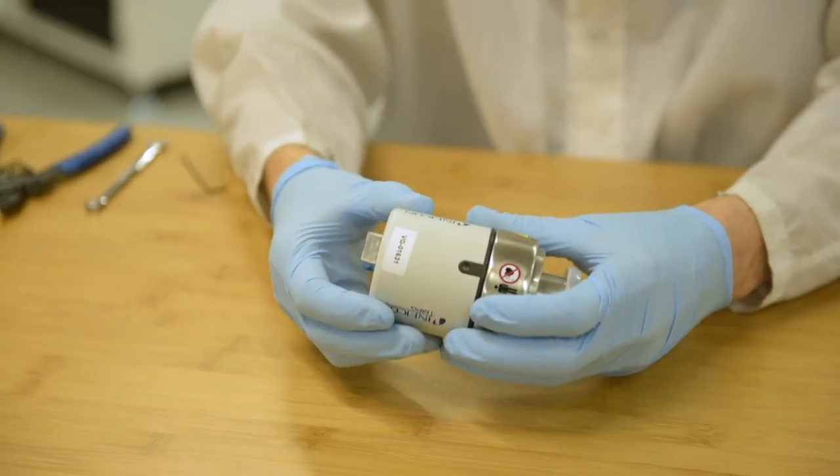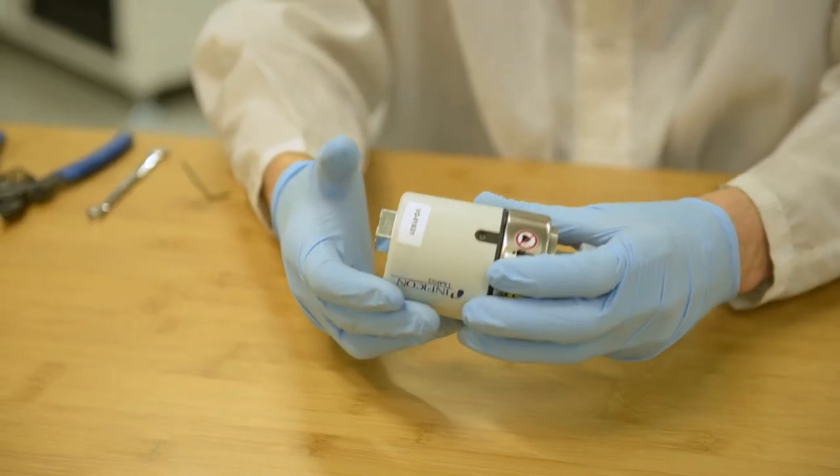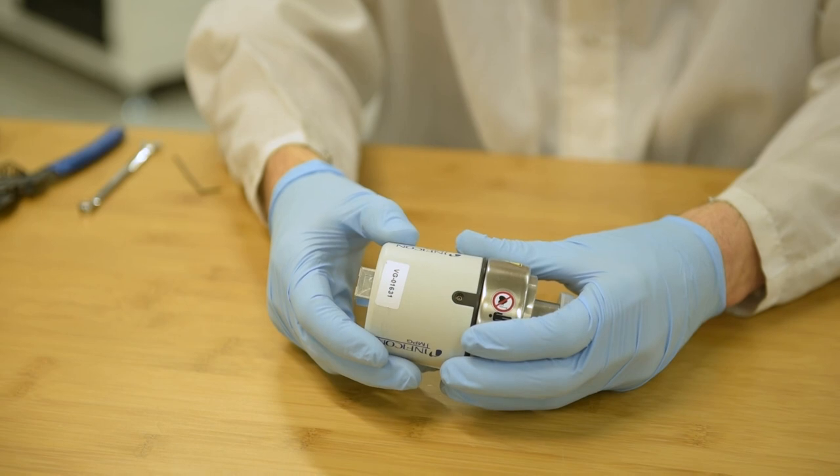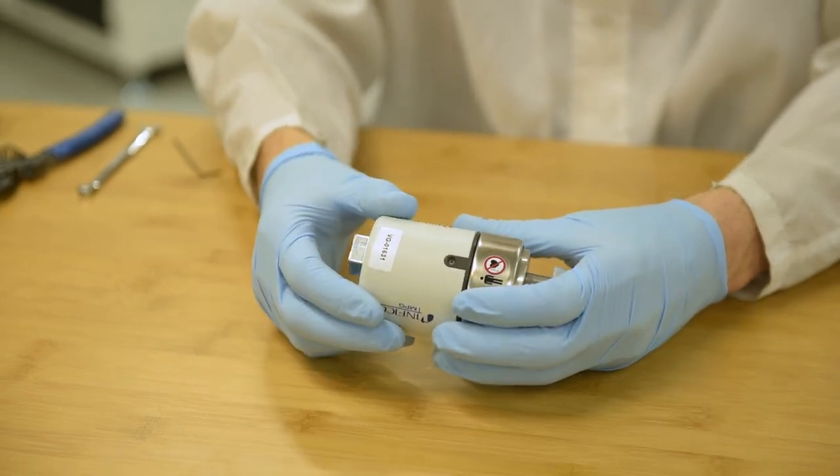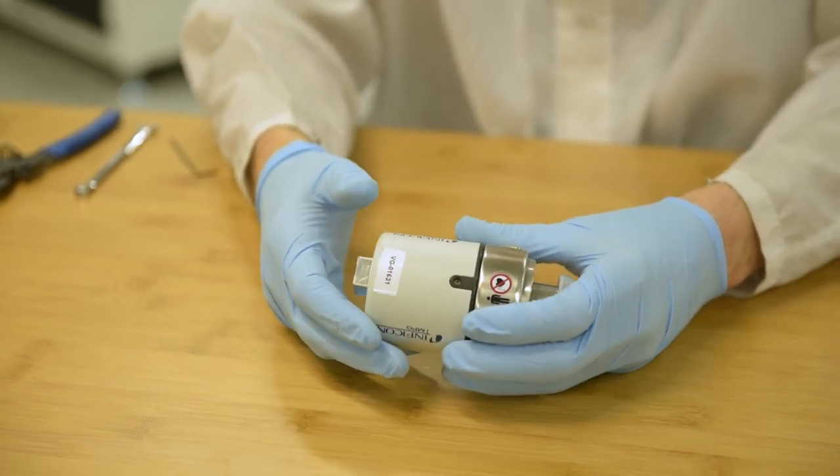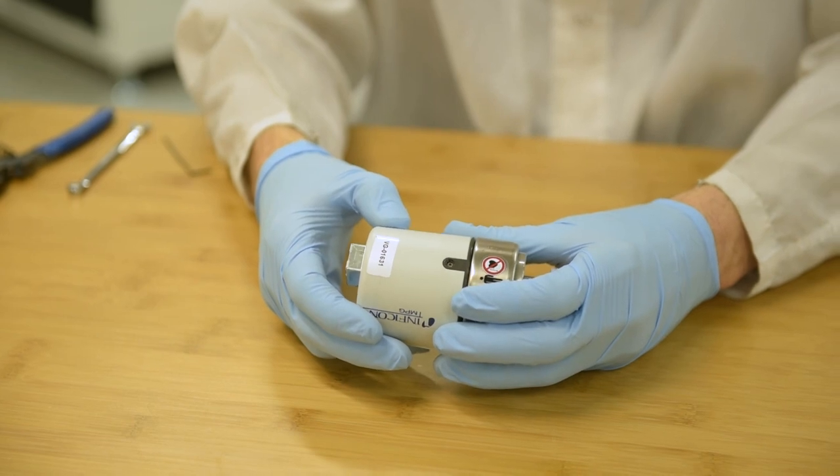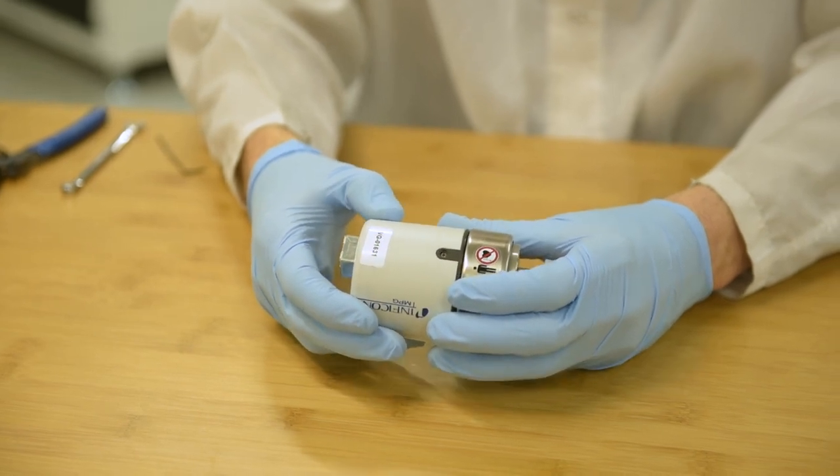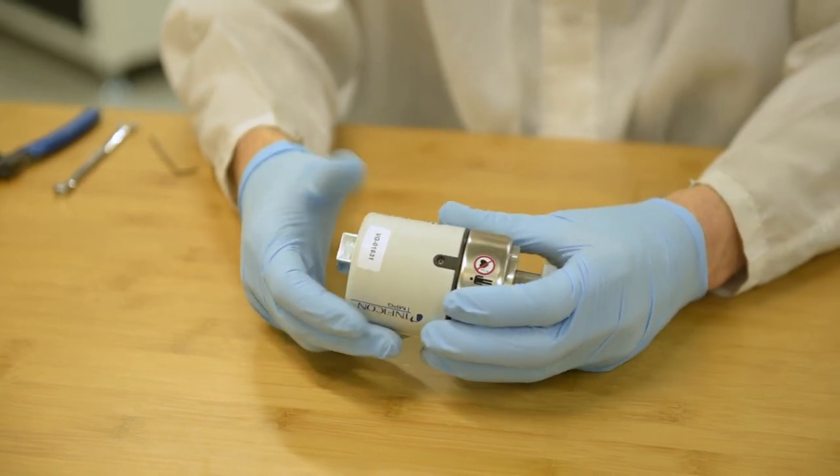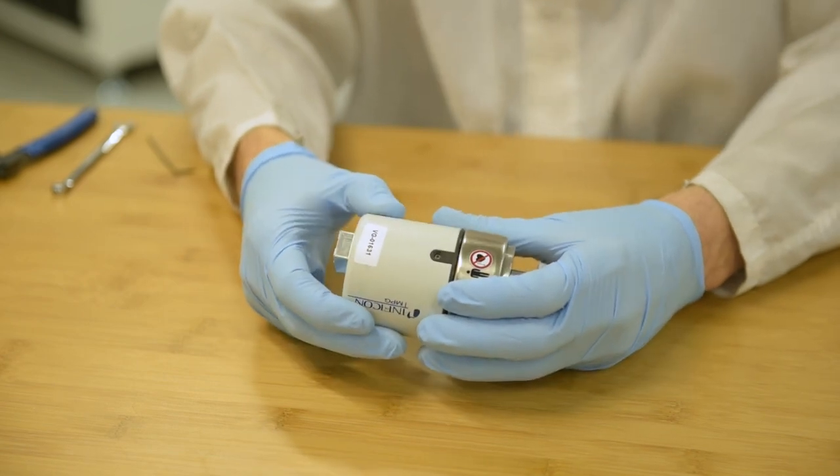This style of gauge is very popular because you can field service it, so you don't have to send it back or send it for repair. You can clean it and most customers can restore the functionality of the gauge simply by taking it apart, cleaning it and putting it back together.